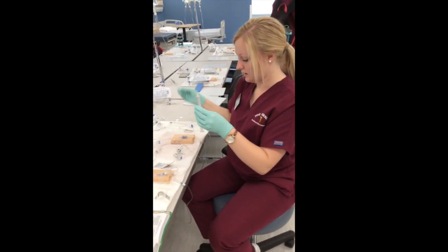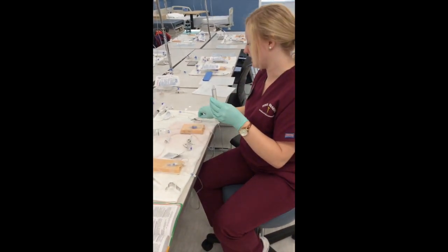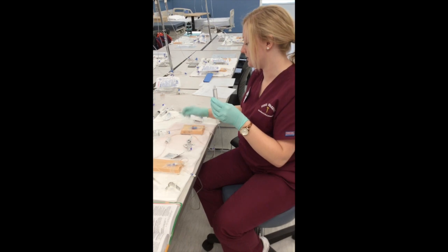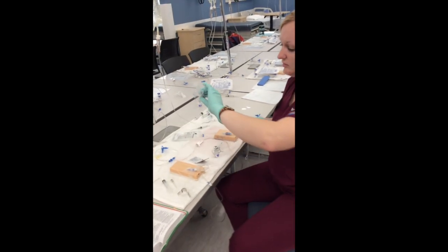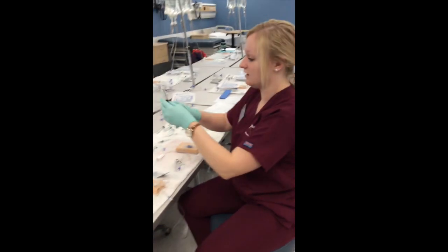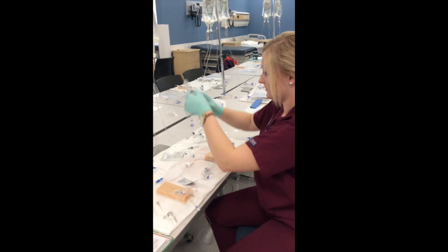Okay. Alright, so then I'm going to recap my needle. Usually in the hospital they have safety devices, so that'd be a lot easier in the hospital. Okay, I'm going to go ahead and mix this. I don't want to shake it or anything, but just gently mixing it. Make sure I get all the air out.